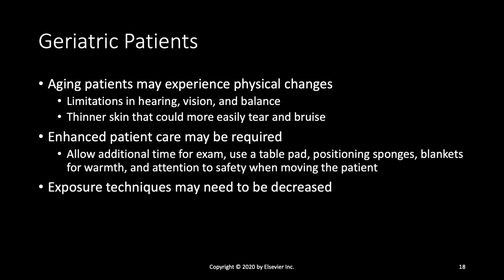Psychological changes in the mental state of the geriatric patients may affect their ability to follow instructions during the procedure. So we should always be prepared to provide enhanced patient care in terms of additional time for the imaging procedure.